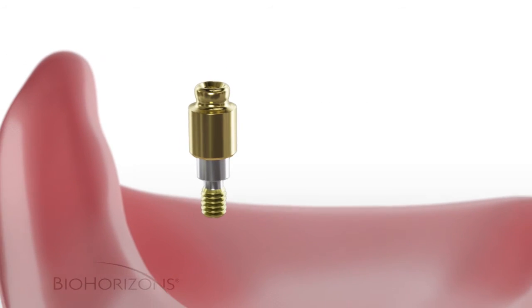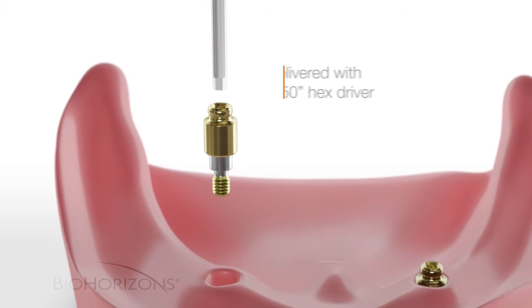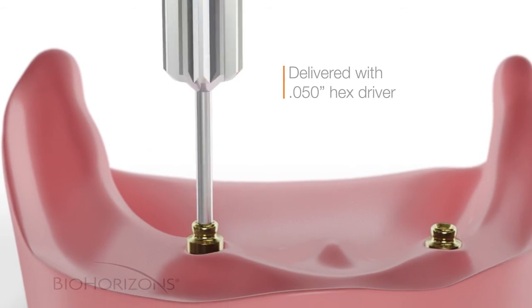The OD Secure abutment is simple to deliver and torque into place using BioHorizon's standard 050 hex driver.